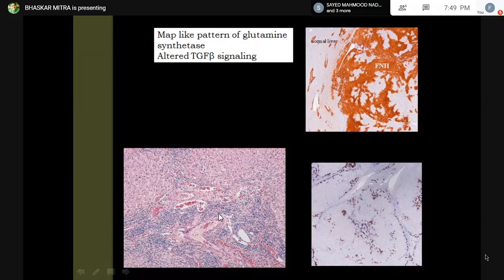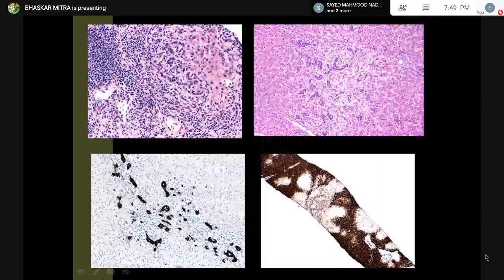Now again, this is a nodule. There is a proliferation of the hepatocytes surrounded by the fibrosis. The fibrous tissue is densely infiltrated by lymphocytes. In the periphery of the lobules, there is a proliferation of bile ductules. These are cuboidal to flattened, ill-formed bile ductules. Sometimes they cannot be well appreciated in the H&E stains. If we do a CK7 on this, the bile ductular epithelium will be well highlighted on this fibrous tissue.